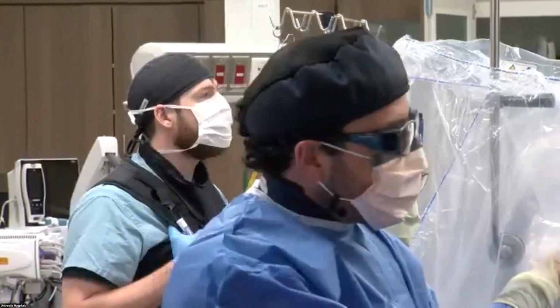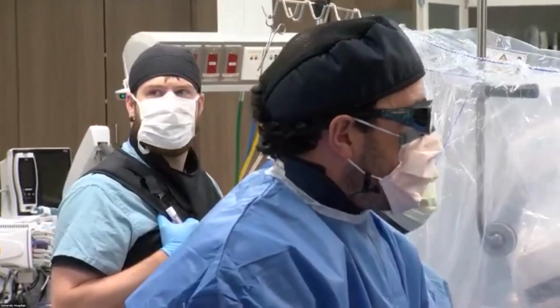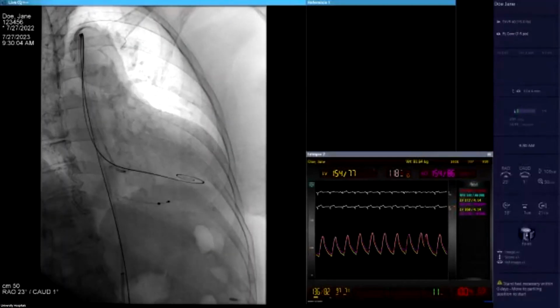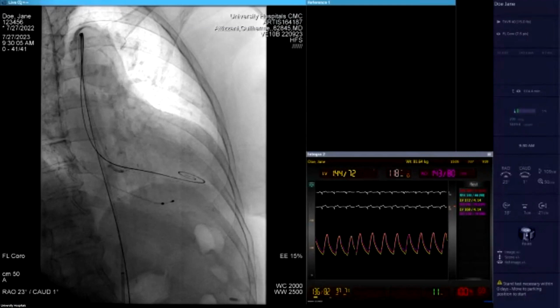In addition, I didn't mention that, but because it's very tortuous, I put a long braided sheath on the left, so we don't fight the tortuosity when we're ready to move the pigtail. That's another important point, because if you need to reposition the pigtail and have to fight with the tortuosity below, it becomes an unnecessary nightmare. So we always plan appropriately to make it happen smoothly.